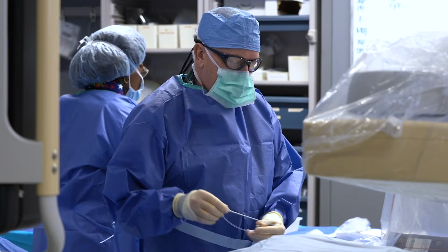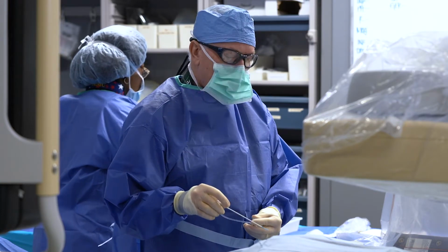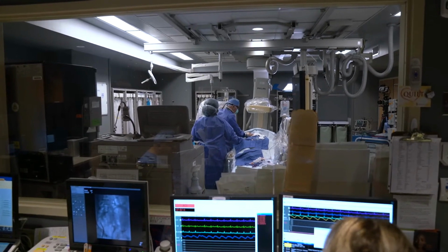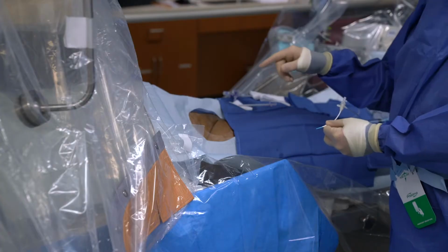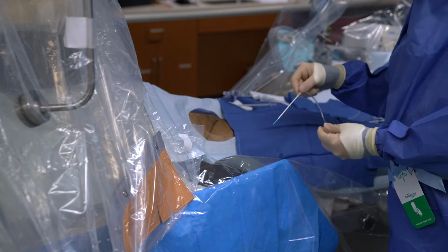And this is a sheath. It's an arterial sheath. And this will be placed in the patient's femoral artery, which gives us access to the iliac vessels and into the aorta that lead to the heart so that we can take the images.